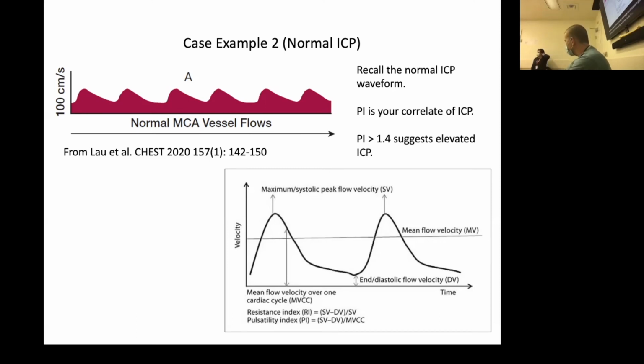So just to carry on with that point, there's no way between 15 and 60 to distinguish, because you still have some diastolic flow. Exactly. Because over 60 is a bit of a janitor diagnosis. Everybody knows he's screwed by the time he's at 60. So is there anything we can do between 15 and 60? Well, I agree, when you're at 60, the writing's on the wall and the dream is over.